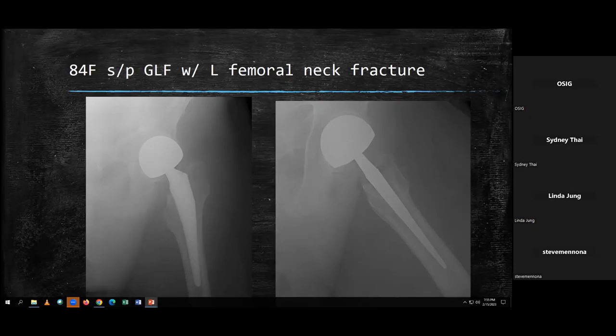So too small, the thing that you're most scared of is what's called subsidence, right? You can imagine two cylinders that don't fit exactly, and the one on the inside doesn't press fit or rely on the hoop stress against the bone, pressing against the circumference of the canal. Over time, as you walk on it, it'll just kind of slide down, right?